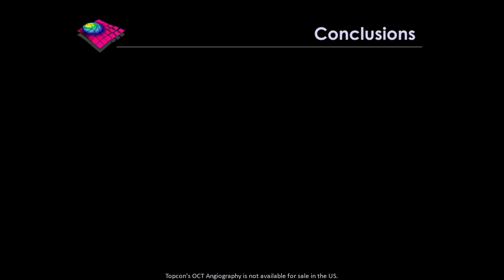Now, just to conclude then, what are my take-home points from this? Well, I think the first is that wide field is key. We must move away from macular scanning of macular edema or choroidal neovascularization. I think that we as ophthalmologists and as retina specialists and other healthcare professionals looking at eyes need to be able to interpret OCT and OCTA through the disc and through the arcades, and I think increasingly through the peripheral retina.